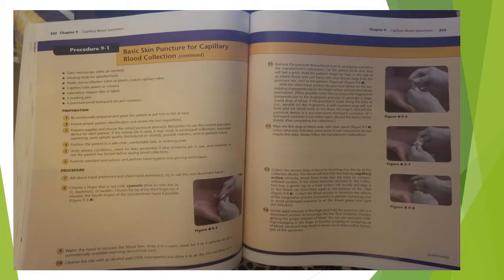Collect the blood quickly to minimize the effects of the coagulation process, microclots or platelet clumping, and to avoid prolonged exposure to air for blood gases and light for bilirubin. Gently apply pressure to the finger and hold the puncture site in a downward position to encourage the free flow of blood, thereby getting the proper amount of blood. Do not use excessive milking or massaging of the finger or forceful scraping or scooping up of blood because it may result in excess tissue fluid and/or hemolysis of the specimen.